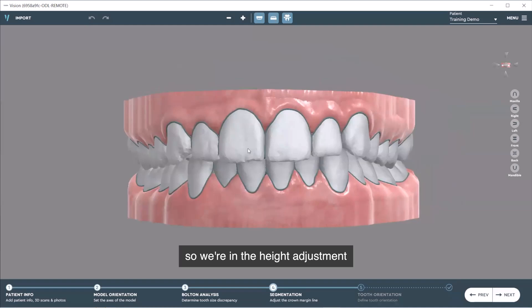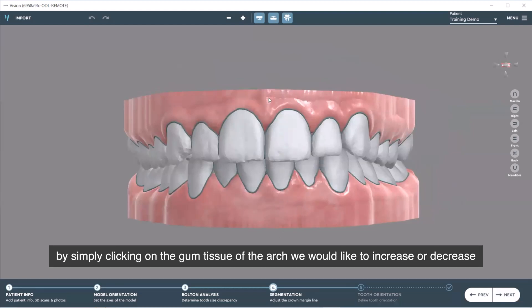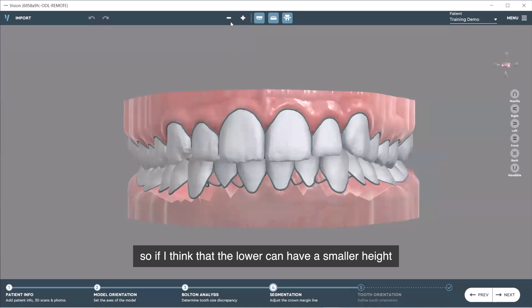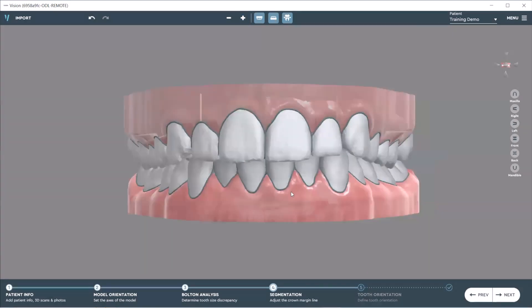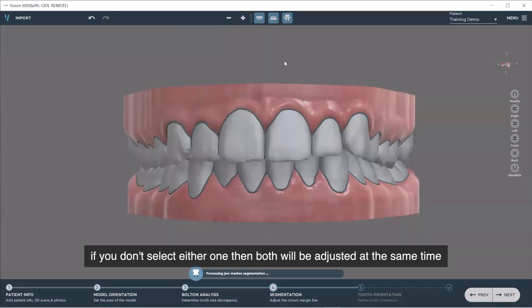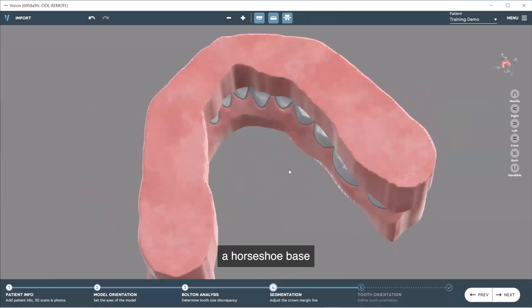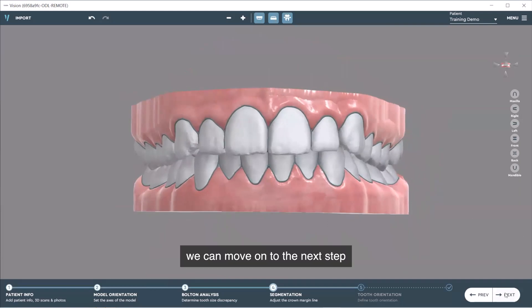We are in the height adjustment scene. You can add more height to both the upper and lower arch, or select only one arch by clicking on the gum tissue of the arch you'd like to increase or decrease. If you select only the lower, you can lower that height, or increase only the upper height. If you don't select either one, both will be adjusted at the same time. You are automatically provided a horseshoe base. Once your adjustments are made, move on to the next step.